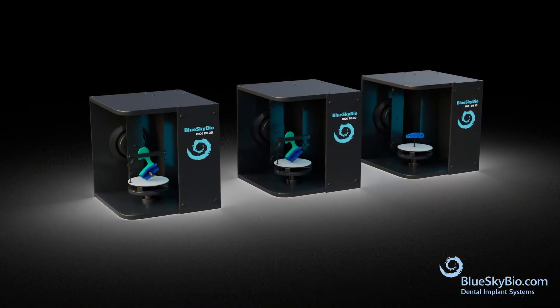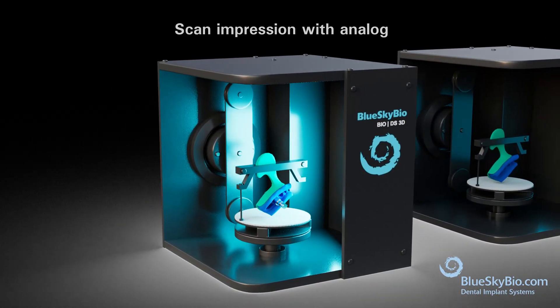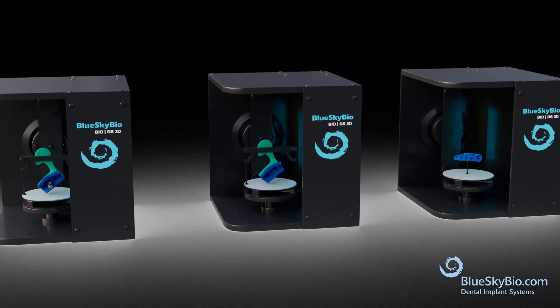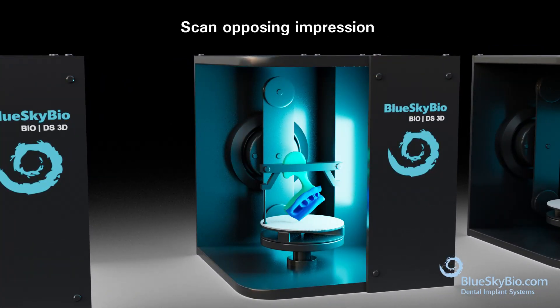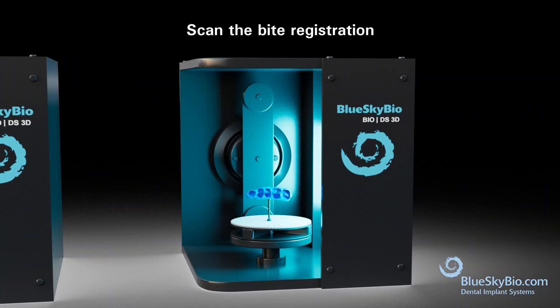Place the impression with analog into a lab scanner and scan. Place the opposing impression into a lab scanner and scan. Place the bite registration into a lab scanner and scan.